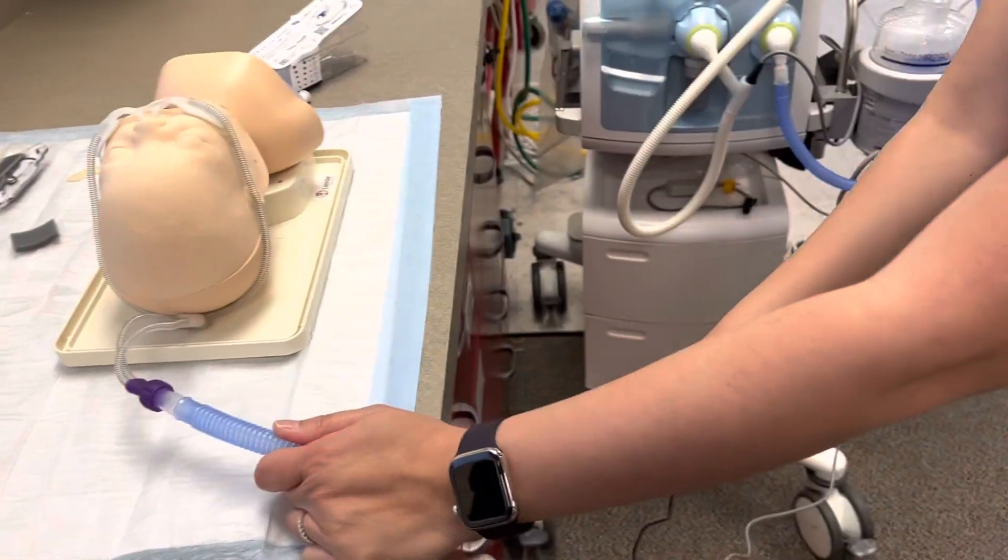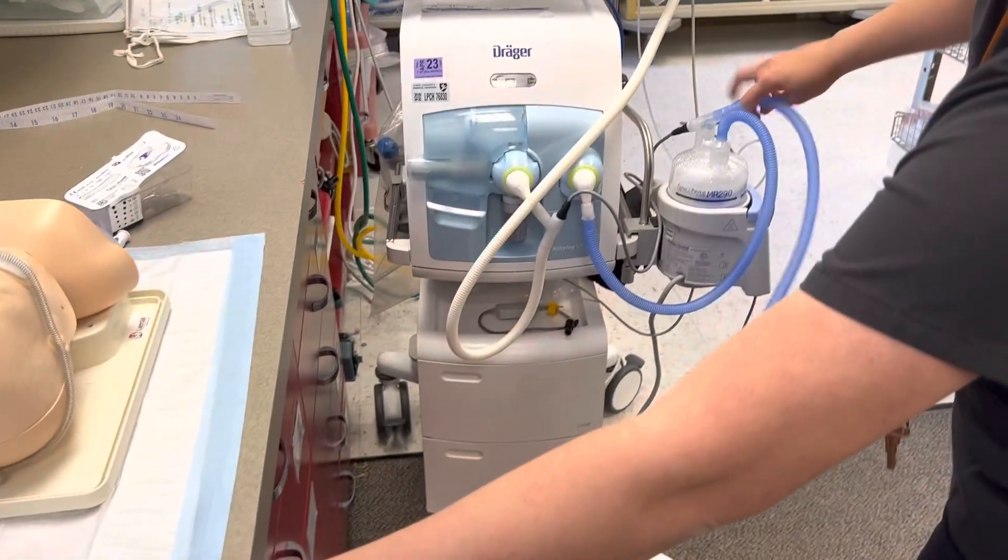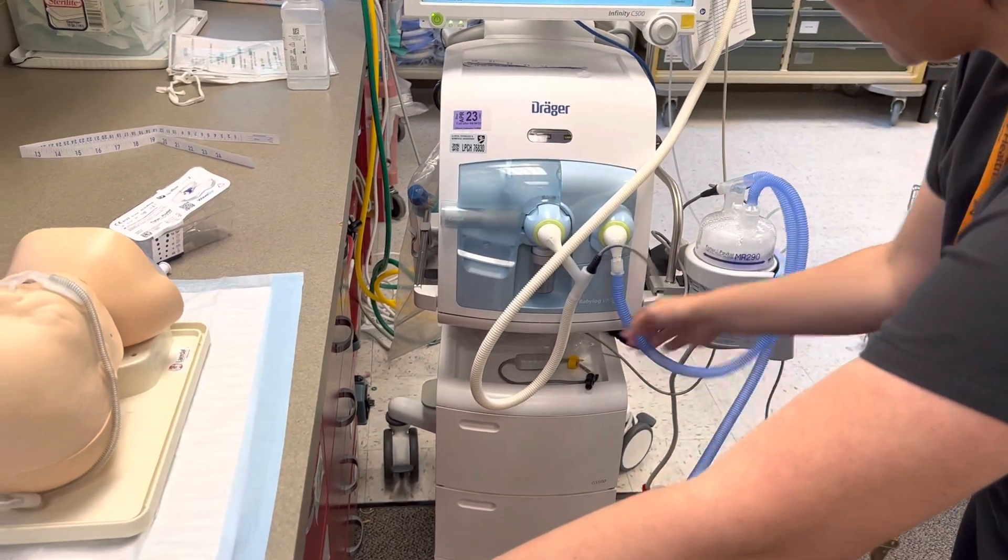Follow back to the circuit to make sure that you are connected. Blue heater to inspiratory.